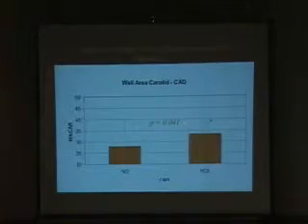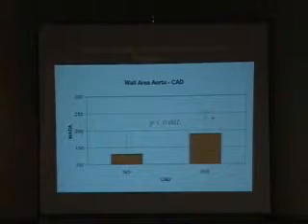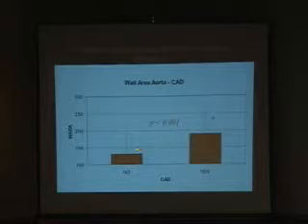But if you now look specifically at the disease itself, and this is the power of this measurement, for example, looking at the wall area in these carotid patient, in this coronary disease patient, looking at the wall area in the carotid. Now, obviously, the group with coronary artery disease is going to have more plaque. And the same thing has happened also in the aorta, that the patient with CAD have not only plaque in the carotid, but also have plaque in the aorta. And now we can differentiate between these two subgroups.